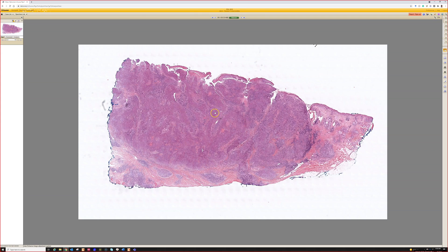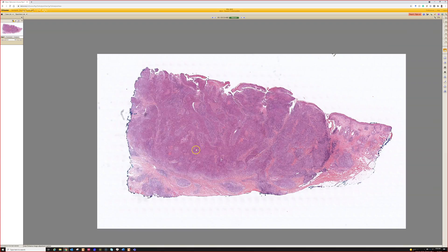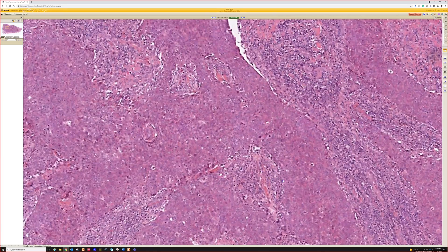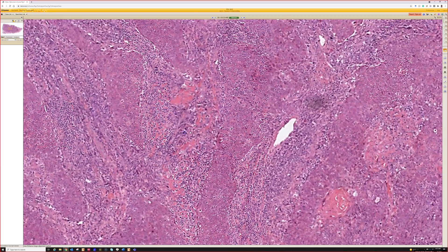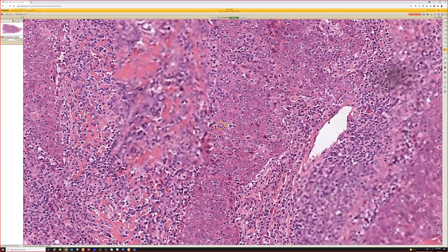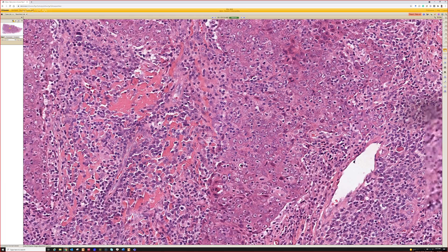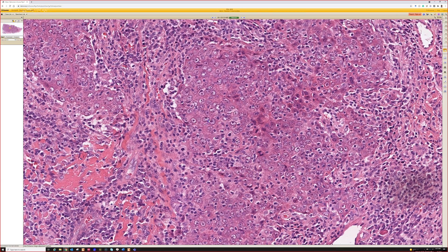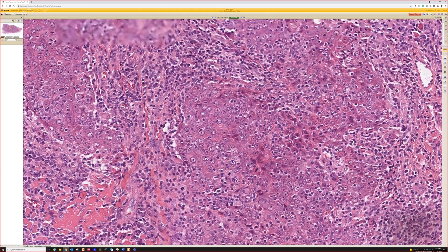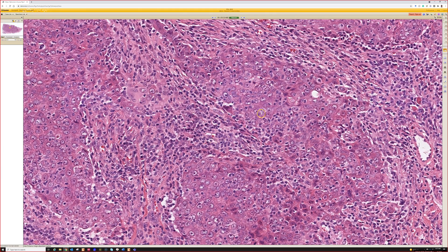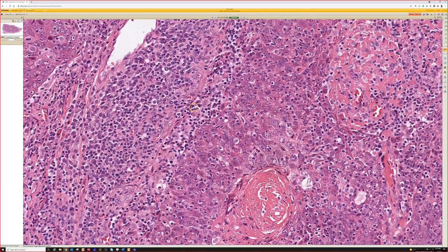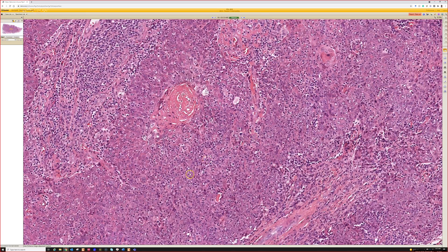This is a big nasty invasive carcinoma, and when you go closer, the tumor cells are very ugly — they've got big huge nuclei with washed out pale chromatin and large prominent central nucleoli. There are lymphocytes everywhere surrounding the nest of tumor and infiltrating into the nest of tumor, and a lot of plasma cells in this one.